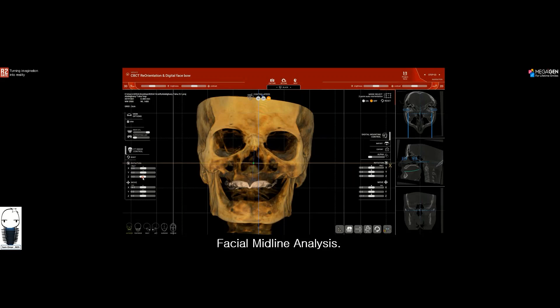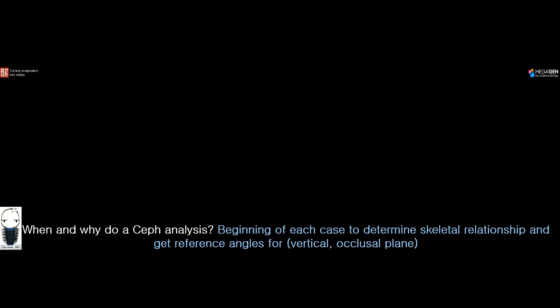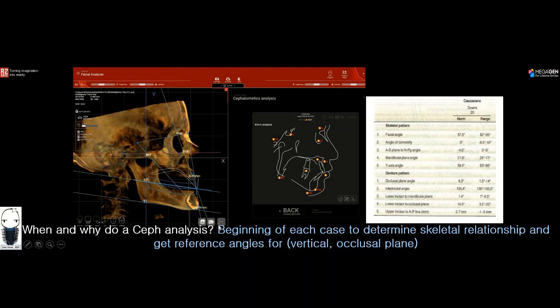Now that we have established a facial midline for the patient — the starting point of our treatment plan — what about the vertical dimension? We always set the vertical dimension in the patient's mouth, a process all clinicians are familiar with. We do our cephalometric analysis at the beginning of each case to determine the skeletal relationship and to get reference angles for vertical dimension and occlusal plane. Step number four, the facial analyzer in R2Gate digital oral design software, gives us important information about the y-axis angle and helps us establish an occlusal plane angle.